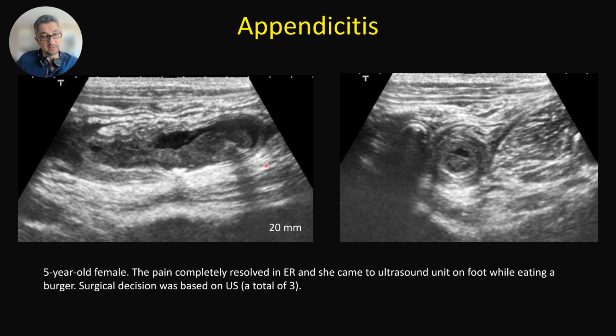The patient comes back the next day without any clinical findings, no pain, and she is eating very well. There is no loss of appetite. We are doing the ultrasound. Second day, calling it appendicitis again. The surgeons don't believe us. Third day, we repeat ultrasound, call this as appendicitis.